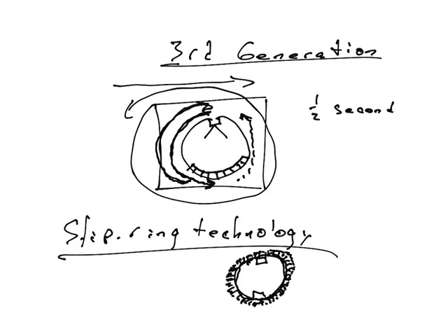With that, you're able to have rotation without the wires getting all tangled up. So if you think of, let's say, an electric drill or something like that, how do you have power to the part which causes rotation without having the wires that give that power tangle up? Well, things like this, slip ring technology, allows it to happen.